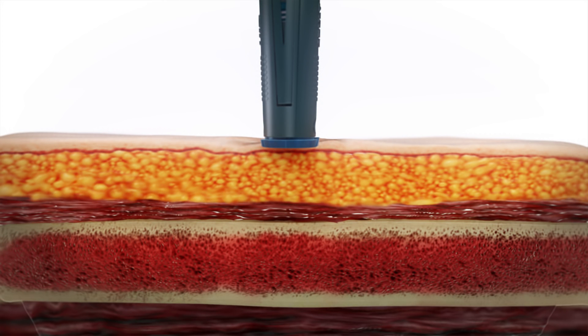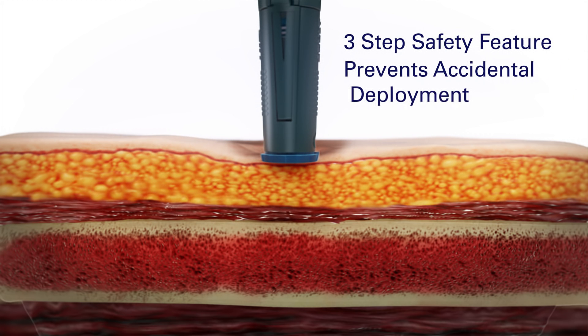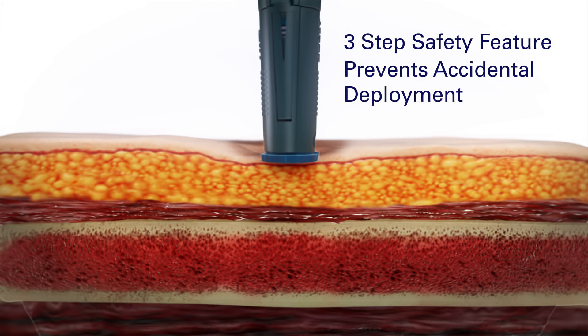When deploying the Neo, the user is required to apply firm pressure with the palm of their hand. This is part of the three-step safety feature to prevent accidental deployment, but also serves another purpose.